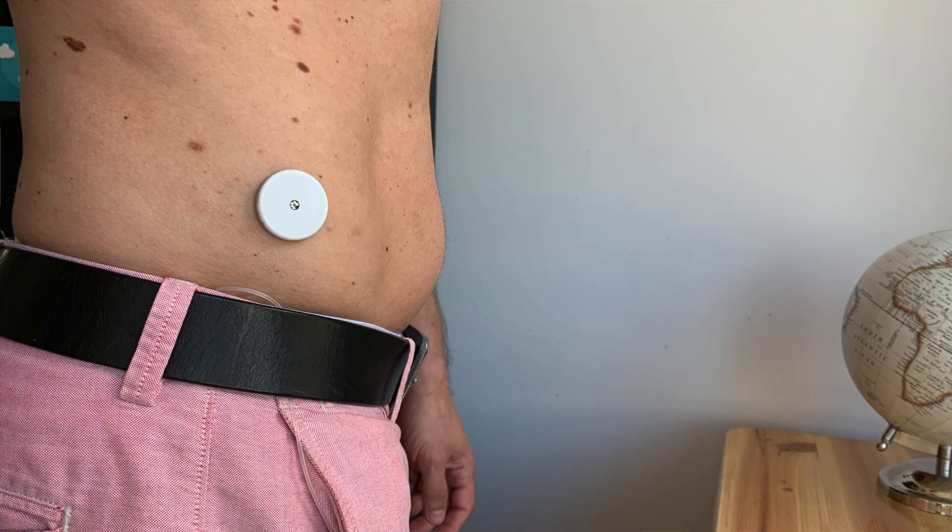If you watched my previous videos you already know that I've been testing various alternative sites for your Freestyle Libre sensor. In the last episodes I reviewed thigh and chest. Today we will look at abdomen, and if you want me to try some other locations that you always wanted to try but were afraid to do so, please write them in the comments below and I will test them as soon as possible. I will share all the results with you on this channel. But now, let's talk about the abdomen and belly and hips and love handles, or whatever you want to call it.